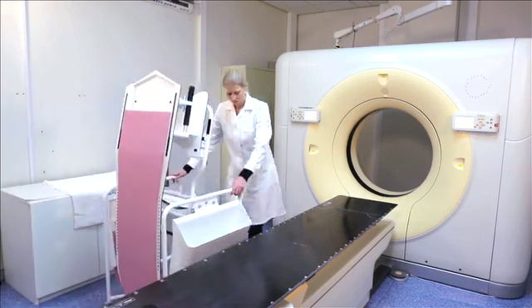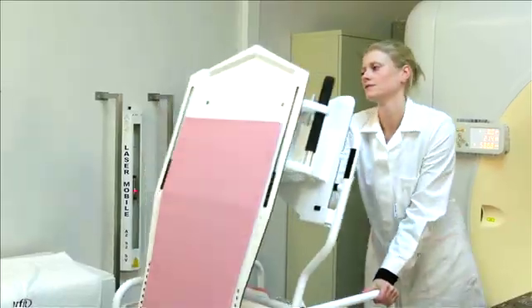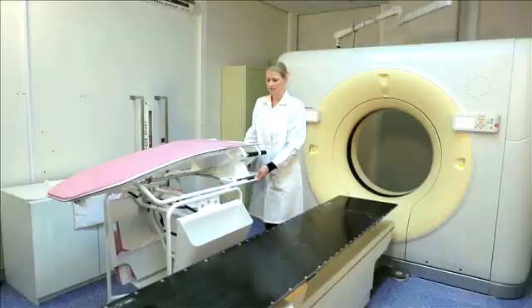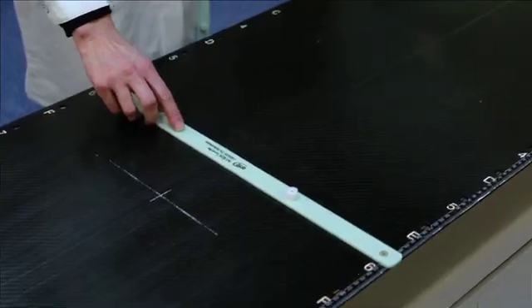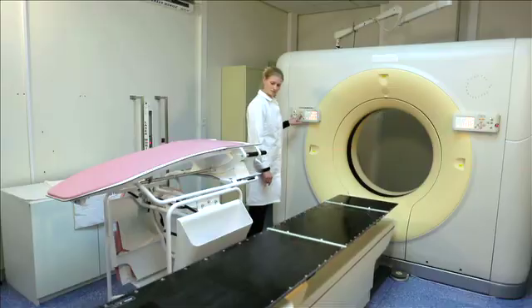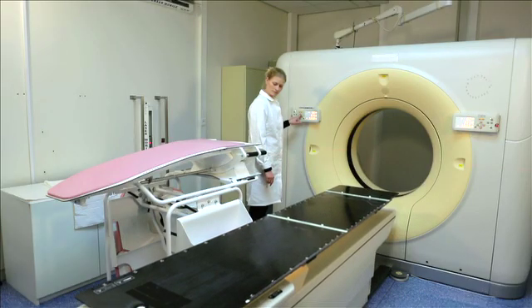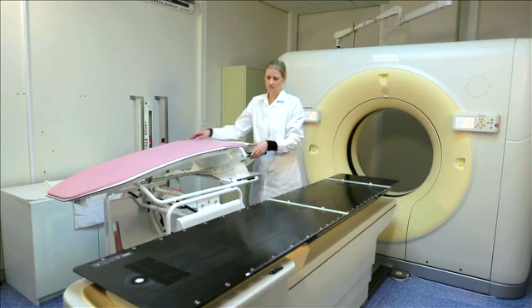Roll the storage cart to the side of the couch and use the brakes to make sure it is locked and cannot move. Use two two-pin bars to position the Sagittilt prone breast solution on the table. Move the couch to the same height as the storage cart in order to easily move the caudal part off the cart.